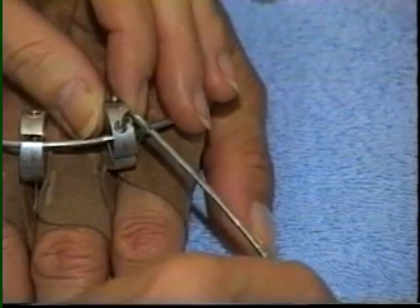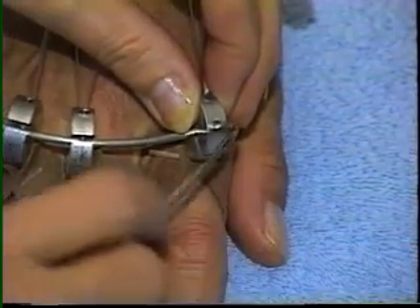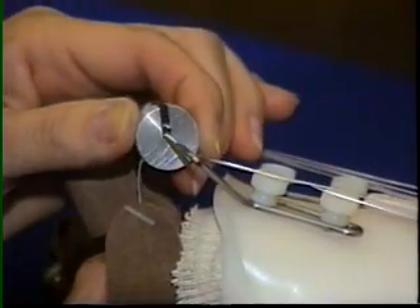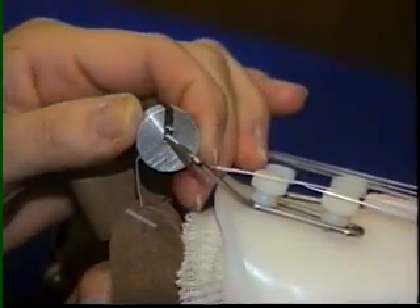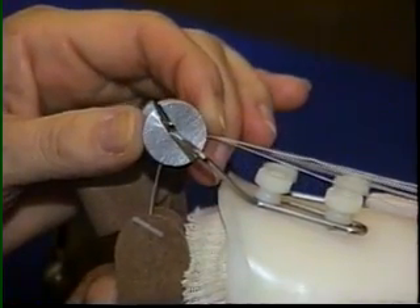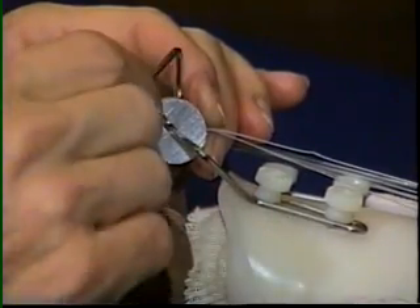The hex wrench is used to release the set screws of each wheel. A wheel is centered over each finger. Then proximal-distal adjustment is set to provide a 90-degree angle of pull as the fingers rest in extension. A full three-fourths inch of adjustment is possible. The set screw is tightened to hold the position.